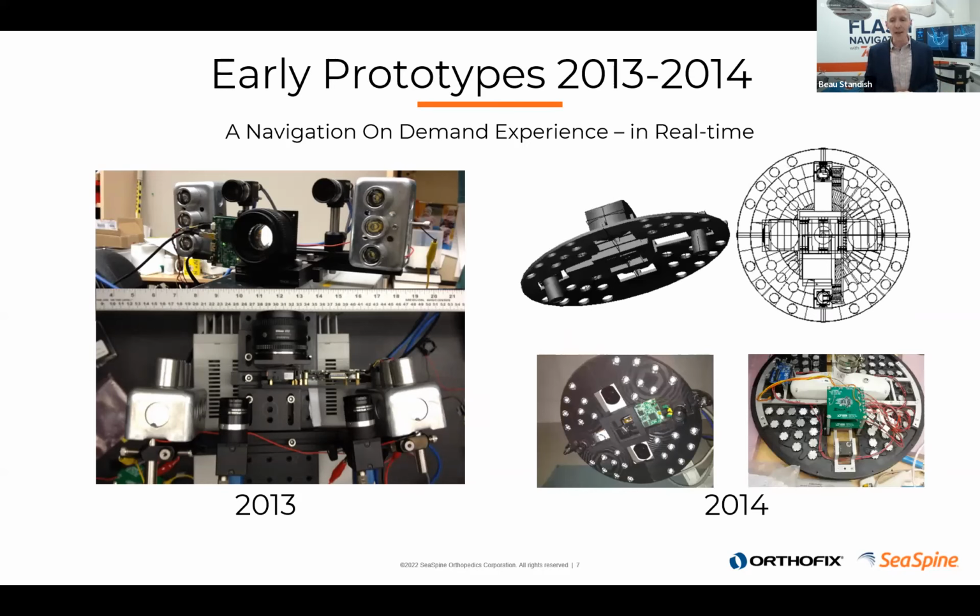3D printing became quite usable in 2013, 2014. So all of our early prototypes now starting to make our own surgical light form factors. You can see here we have lights embedded inside of the system. We have trackers, we have different computer boards. For those of you who are garage techies, you might even be able to spot things like an Arduino controller that are very common today, and Texas Instrument control boards. So really, first principles prove that the technology works from a very primitive technical state.